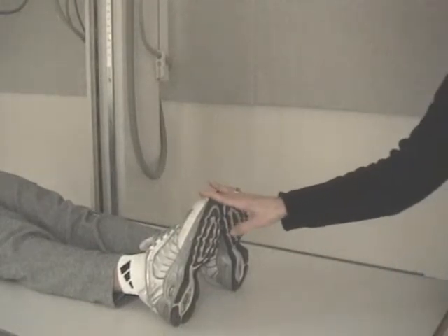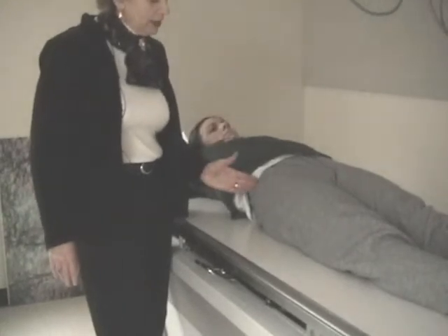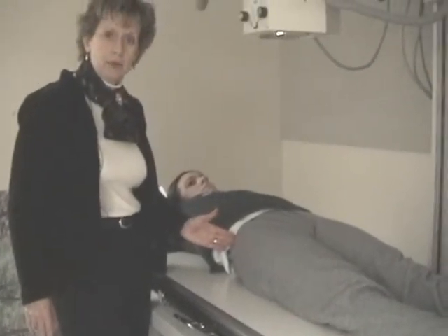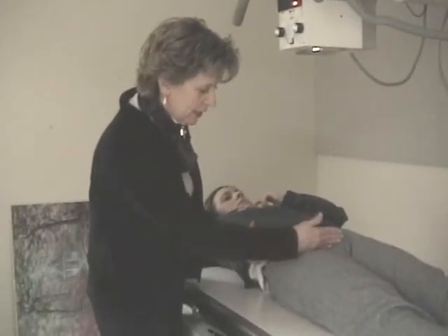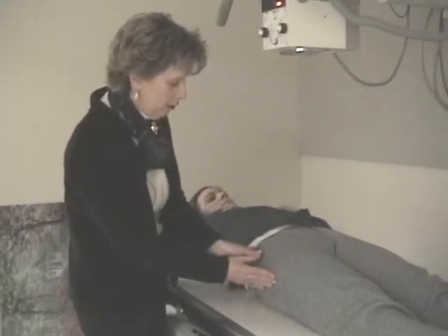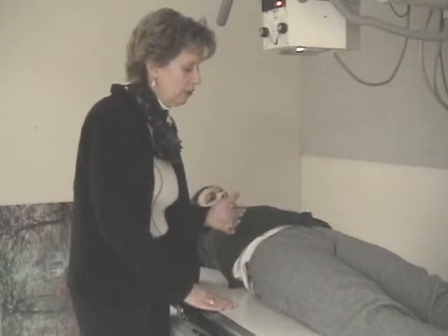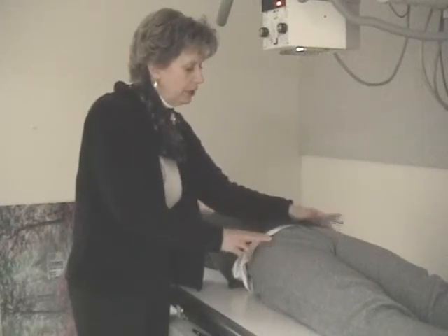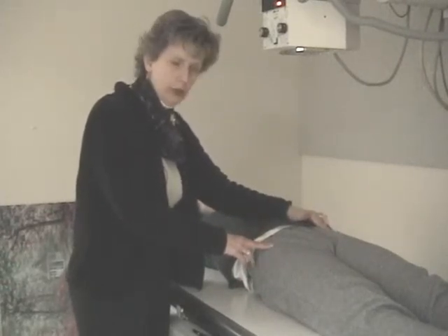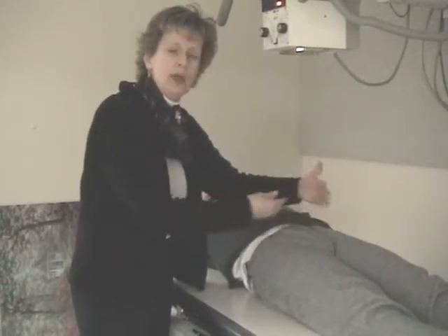Okay, this is an AP pelvis. I will hit the high points again and tell you what the image will look like. You want the film's edge 2 inches above the iliac crest. Whenever possible, center your anatomy. So I found the trochanters, or I can see the pubic bone, and I centered the pelvis this way, which means the mid-sagittal plane to the center of the film. I made sure that there was no rotation. If there's no rotation, the wings of the ilium will be symmetrical. The two sides will look alike. The obturator foramen will look alike.